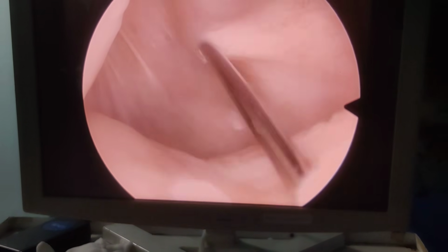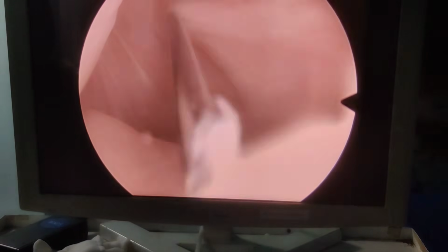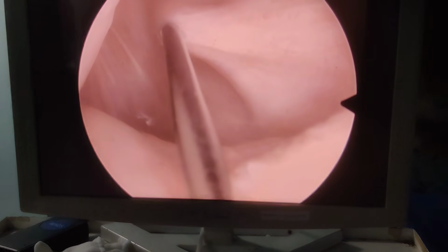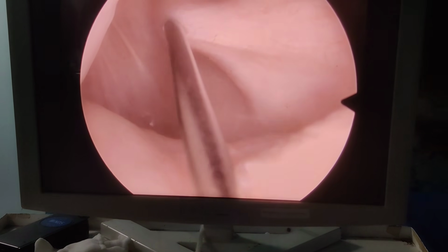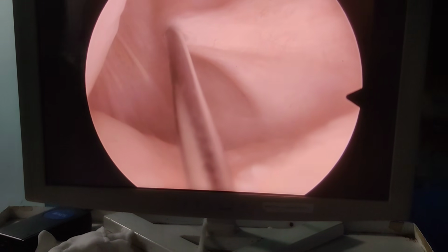So I'm just going to use a needle, knife over it, and then we will shuttle something like a messenger rod, and then we'll put something like a floppy sheath to keep it so that we have this access all the time, and we are not struggling when you're getting an instrument in and out.